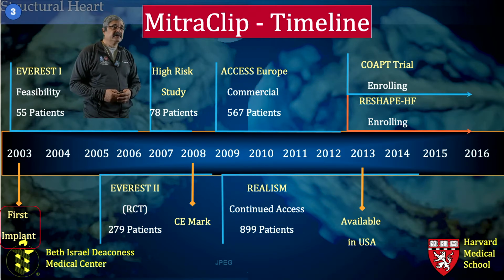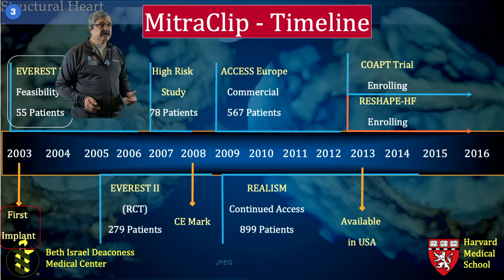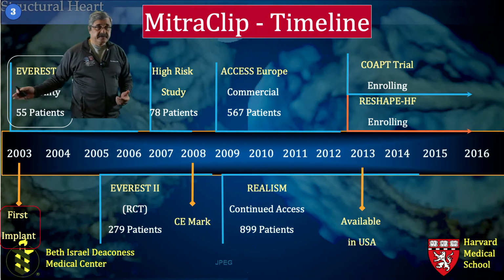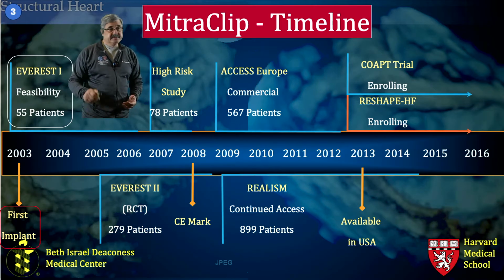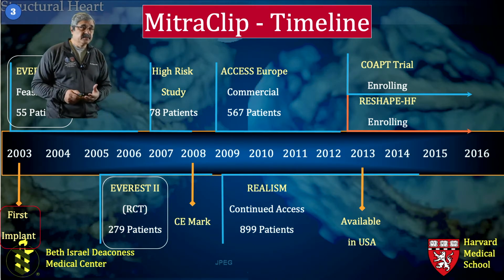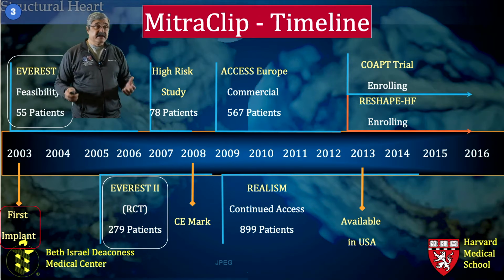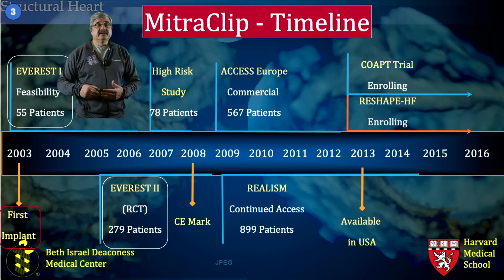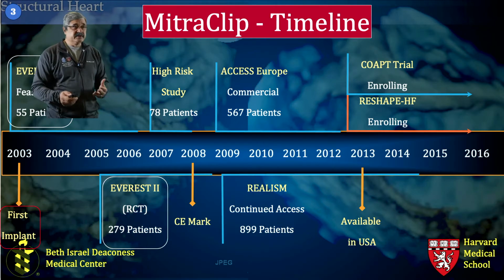After this was the Everest trial, which was conducted entirely in Europe and consisted of just 55 patients, and demonstrated the feasibility of doing MitraClip in these patients. The next one was a randomized controlled trial between surgery as well as MitraClip and guideline therapy, which demonstrated the safety and the comparability of MitraClip with the surgical repairs of the mitral valve.